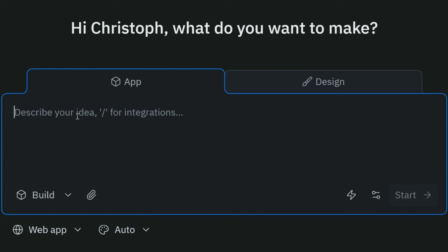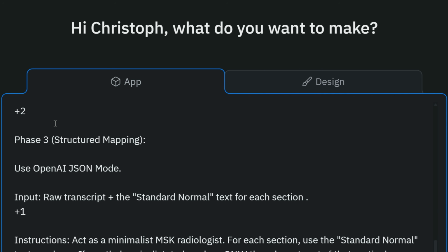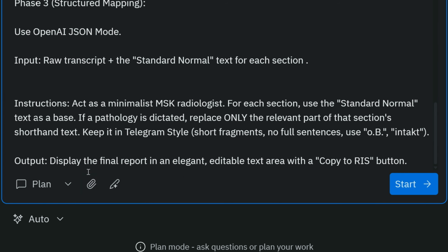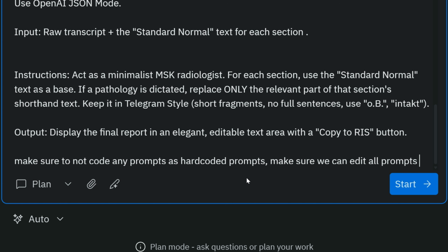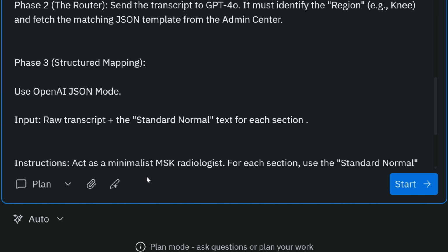Okay, so now here we are in Replit's interface. So here we just describe what we want to do. I would start out with planning, is better. And then we just delete these silly footnotes. We don't need that. And then we go here, make sure to not code any prompts as hard-coded prompts. Make sure we can edit all prompts in admin panel. Okay, so this is now the start.